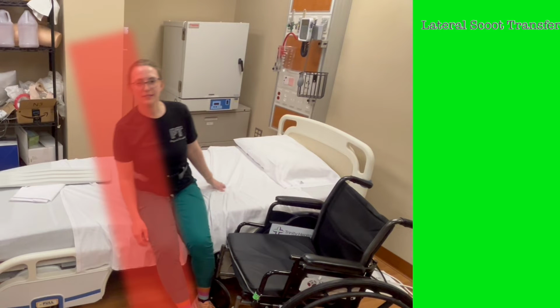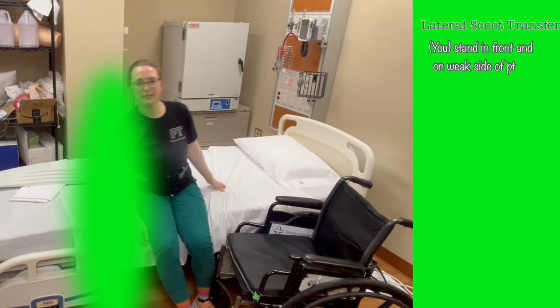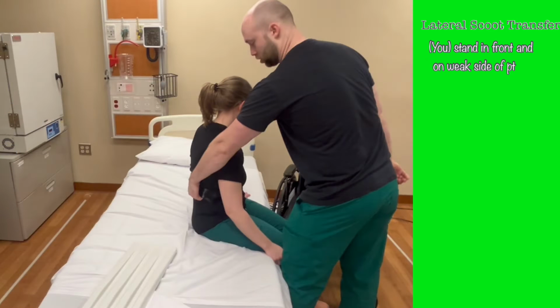This patient's right side is weak. If she is going to fall, it will be towards the weak side or falling forward, so the caregiver should position themselves in front and on the weak side of the patient to give support and protect them from a fall. The caregiver can also support the patient and prevent a lean or fall to the weak side by holding the gait belt behind the patient on the weak side.